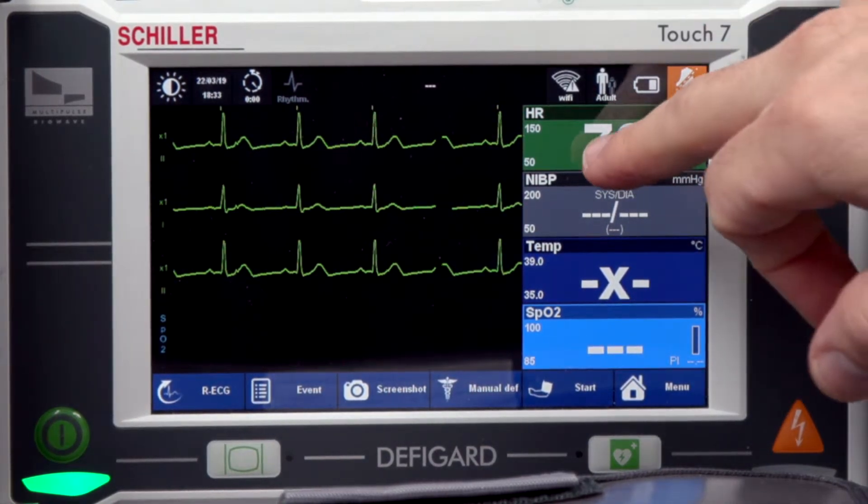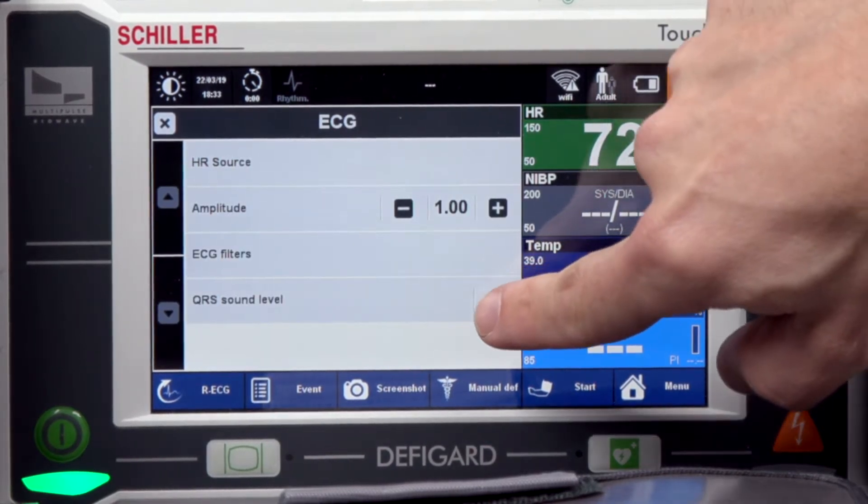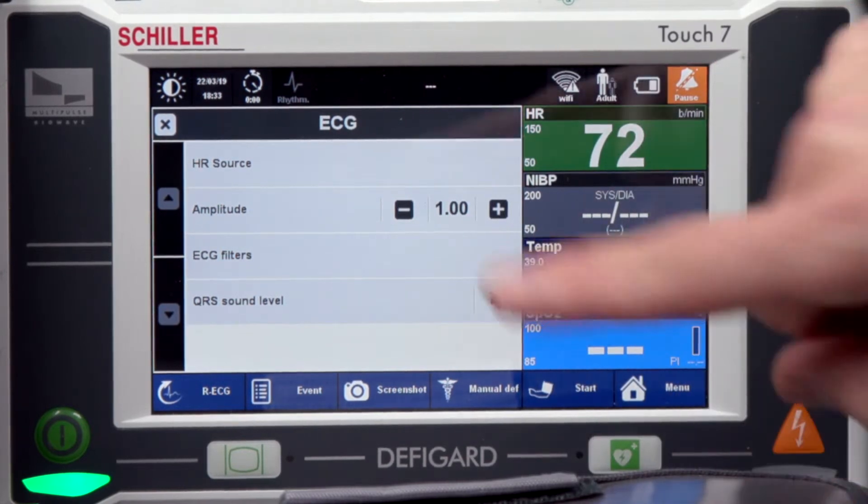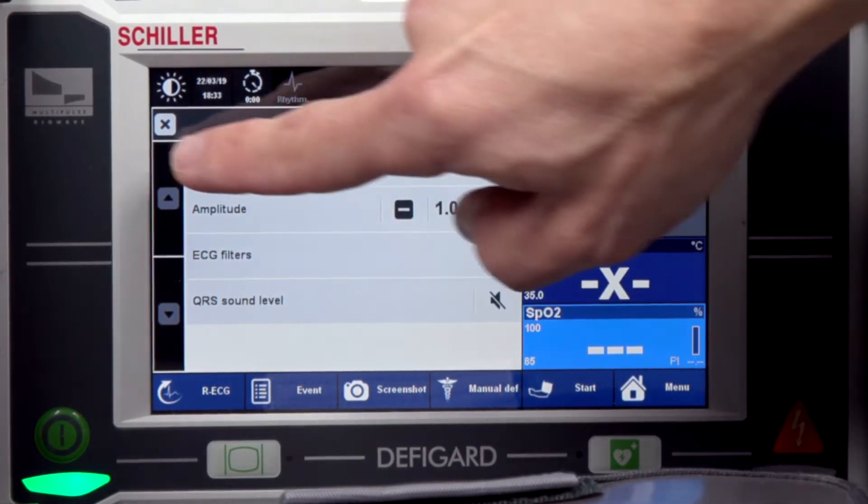If I want to turn off the QRS beat, touch the heart rate, and then just touch QRS sound level until it is silenced.